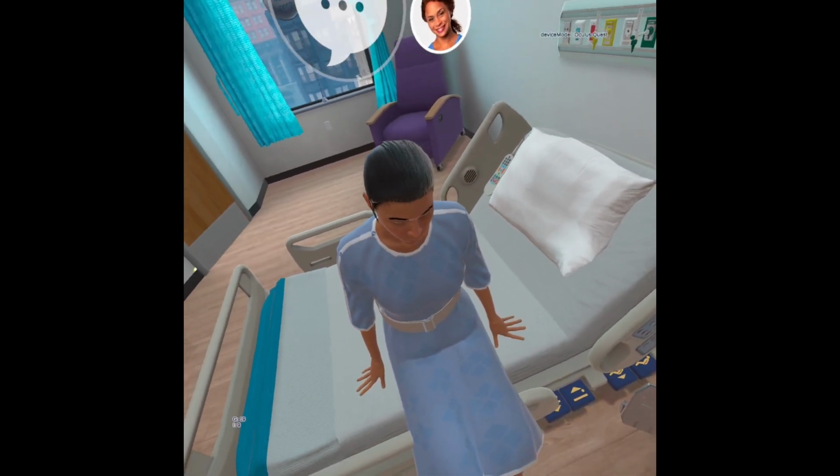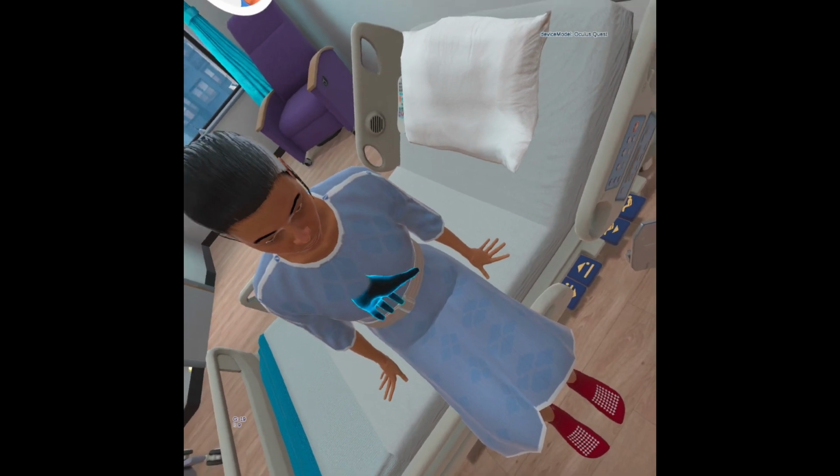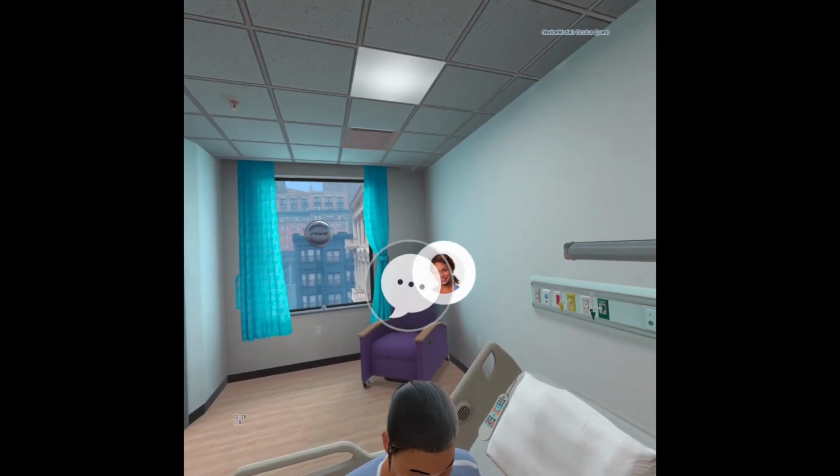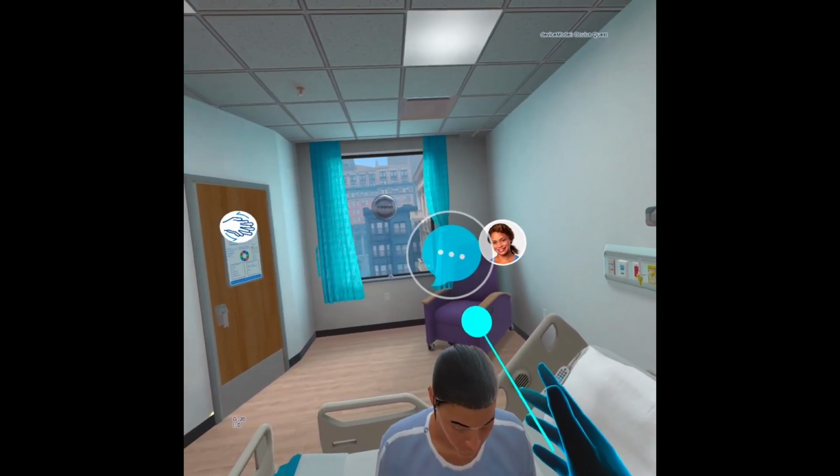What do you need to check? Good. The belt fits correctly. I'll tuck the loose end into the back of the belt so it stays out of the way. There. Explain the next steps to Heather.